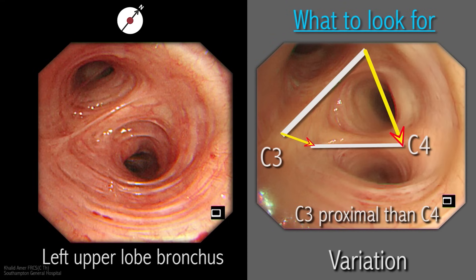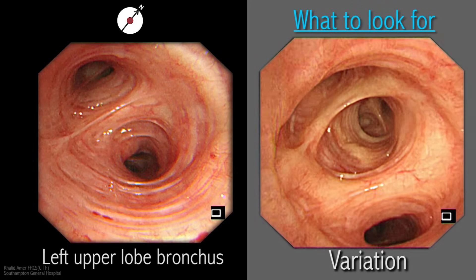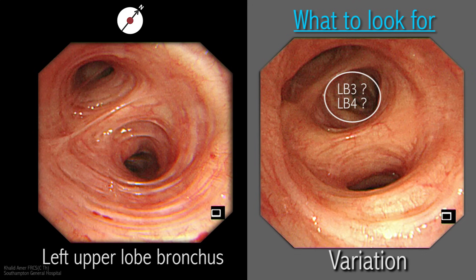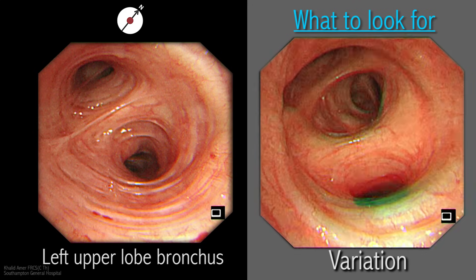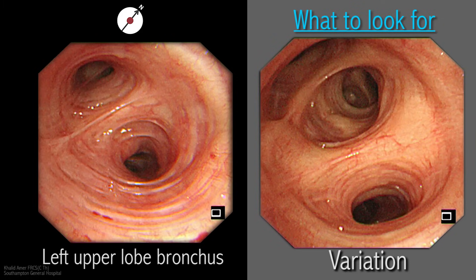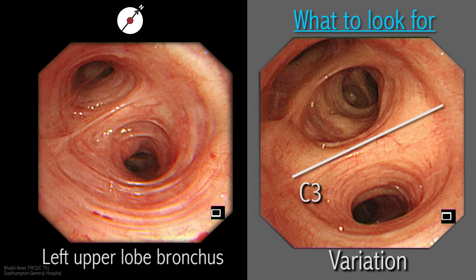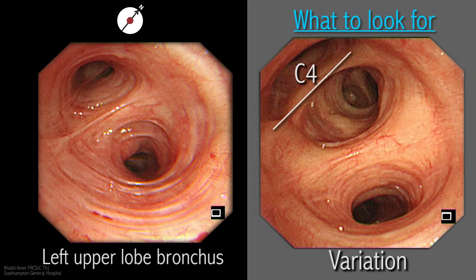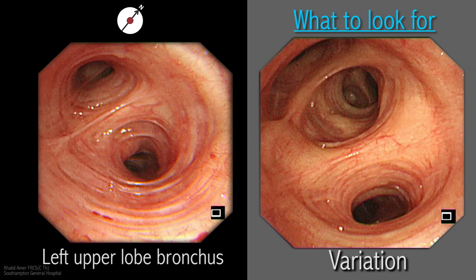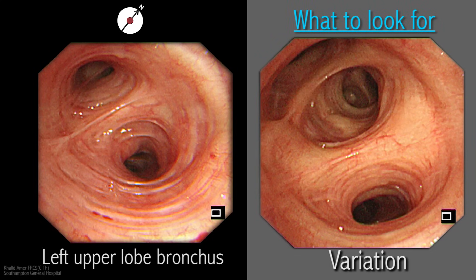This becomes even clearer when the view is magnified and the hierarchy of the carinae is well established. This is another example highlighting the same problem: the left upper lobe has three divisions and the middle one is a dilemma — it could be LB4 (superior segment of the lingula) or LB3 (anterior segment of the upper division). The deciding factor is proper identification of the carinae. The higher or more proximal tertiary carina C3 compared to the lower quaternary carina C4 clearly divides the lingula from the upper division, and the middle orifice in this example belongs to the upper division — therefore it must be LB3. This is made clearer when zooming in to enlarge the origin of the carinae.